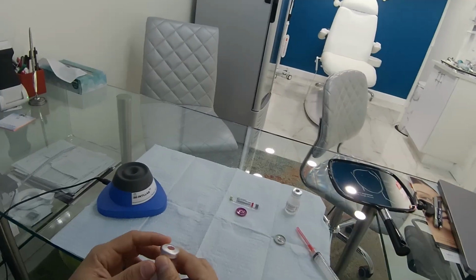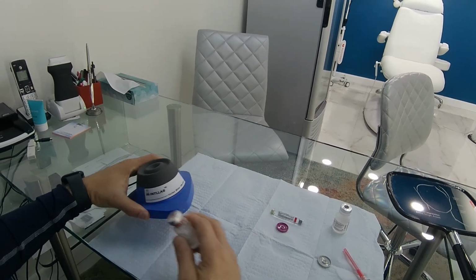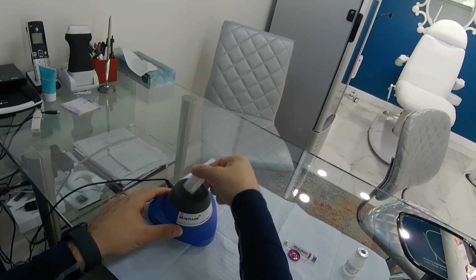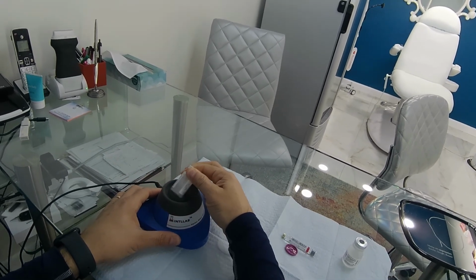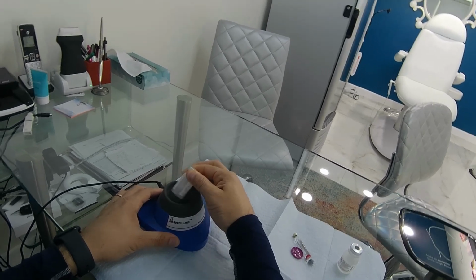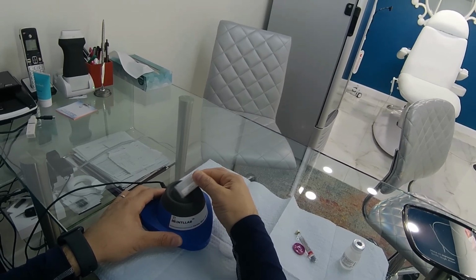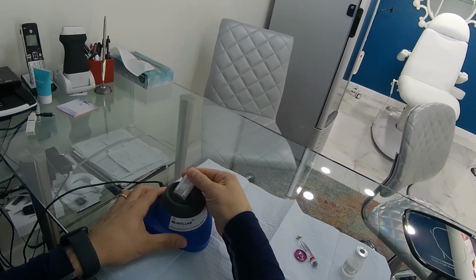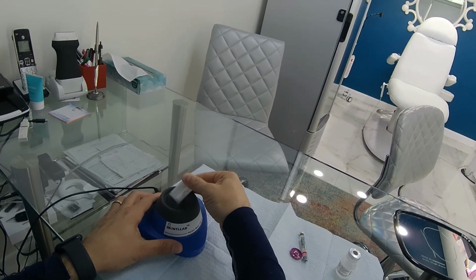Okay, so now that's what I was talking about, and this is like a vortex mixer. Then you just press it and start mixing, and if you notice, even how much pressure and the angle at which you mix it will make a difference. For example, if I do it like this, it's mixing better, so you just find an angle and a pressure that you put on the mixer to make sure that it's really mixing in the best way.